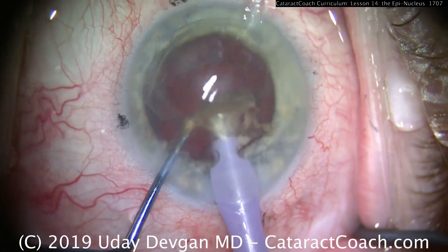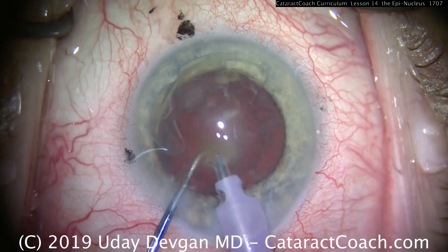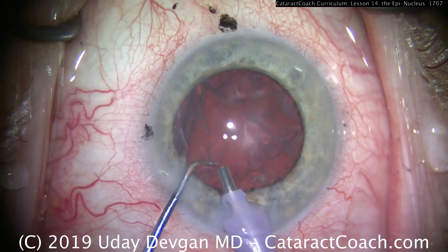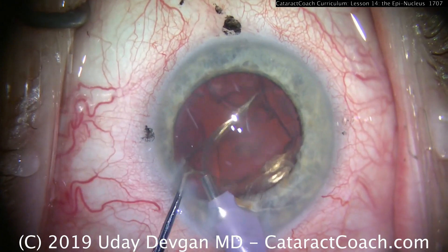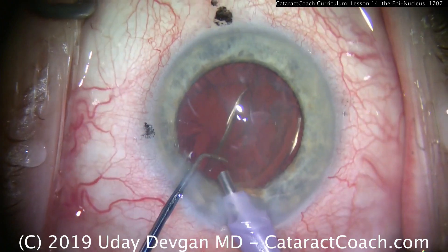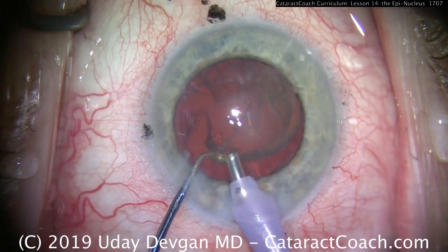So during FACO, here we've removed the central endonucleus and we're left with an epinuclear shell. We can grab it with the FACO probe. The key here is just using vacuum — a mild or moderate amount of vacuum and no FACO energy — and then we bring this shell out of the capsular bag.